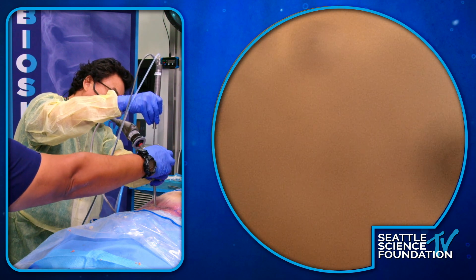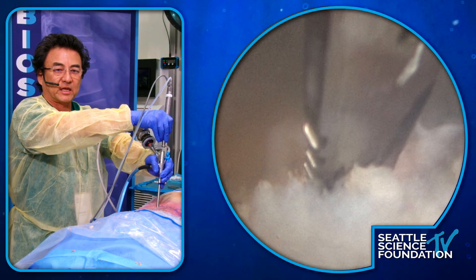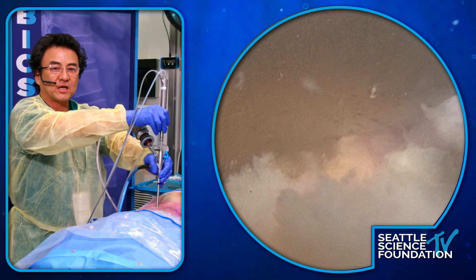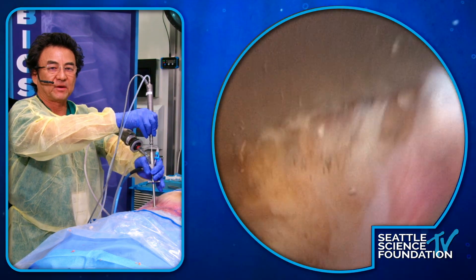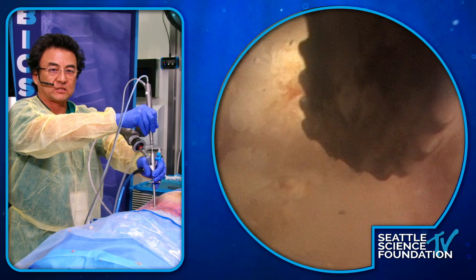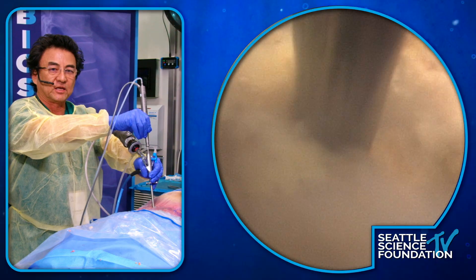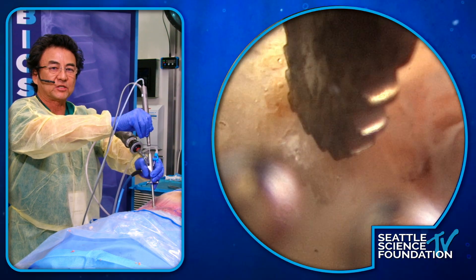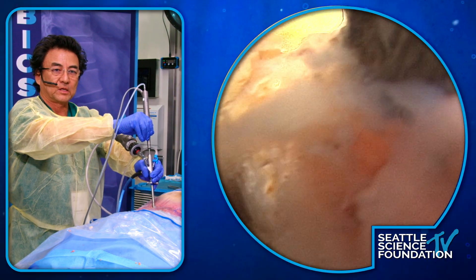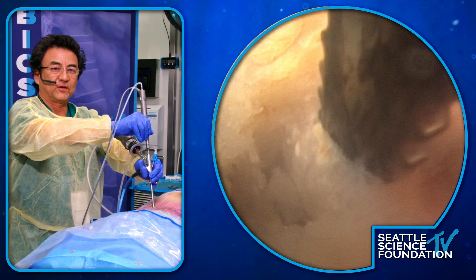You can imagine if I wanted to make an L-shaped cut — like in the inferior edge of the cephalad lamina on an interlaminar approach, or I wanted to truncate the cephalad tip of the superior articular process — I can just create a line, go deeper, and crosshatch to start breaking it off. What I don't do, like I do with the burr, is go all the way down to the ligamentum flavum, because I have a hard time feeling that release on the other side. I want to get to the inner table and then do it under direct vision.